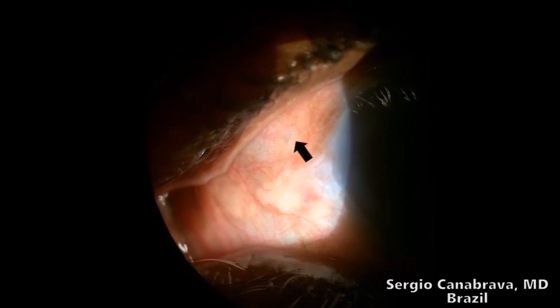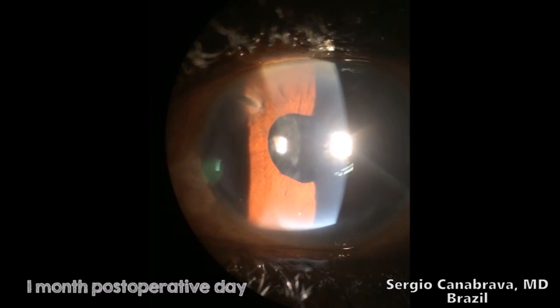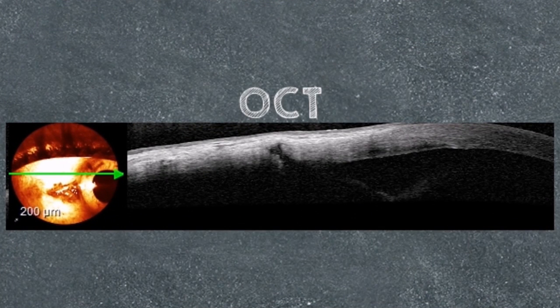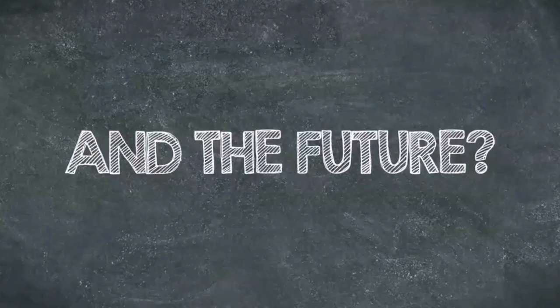In another patient, you can see the flange and how the IOL is stable in the bag. This is a UBM image — number 2 shows the flange, and number 1 shows the capsular tension segment. In the OCT, you can see the flange in the sclera.